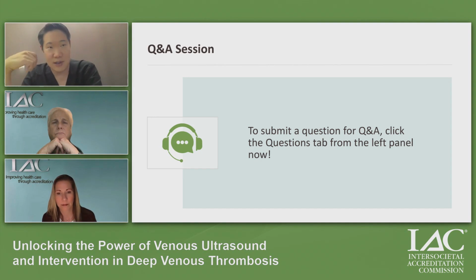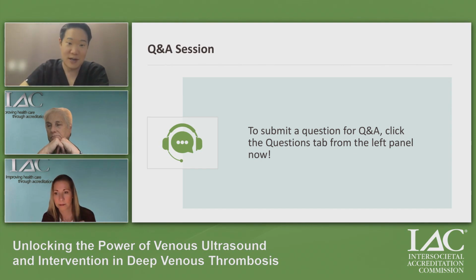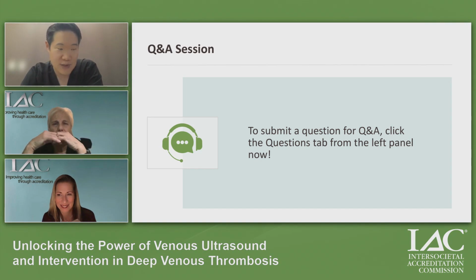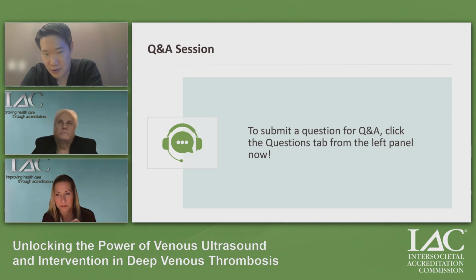And so when there is a patient that actually does have a calf vein pathology, or maybe it's not even isolated, maybe it's calf vein pathology plus other stuff going on, you know who's interested in that? I'm actually interested in that. Maybe less interested, but I'm still very interested. For me to know that there is a calf DVT and a femoral-popliteal DVT versus a femoral-popliteal DVT and the calf veins are open makes a big difference for the way I approach that patient. And so if you're able to give me that intelligence on that patient reliably every time, that means something. But the only way I think to do that in a very, very good and reproducible fashion is to scan every time.